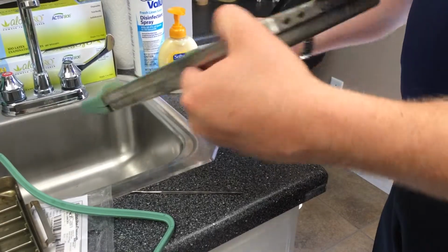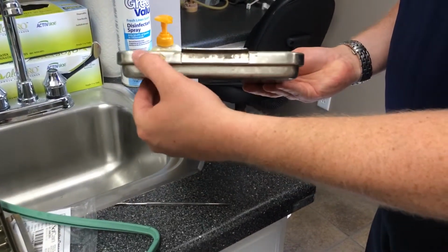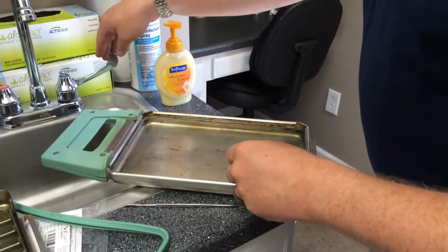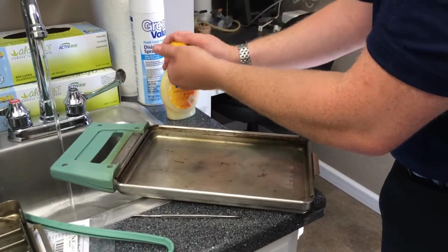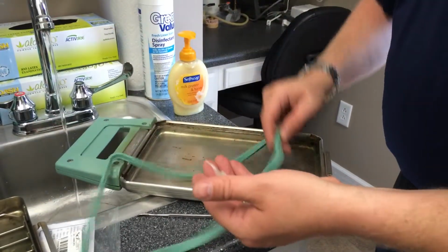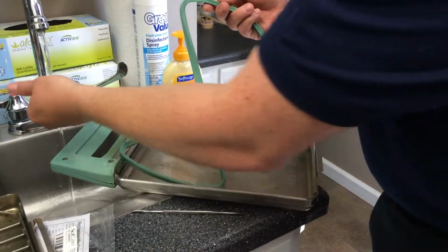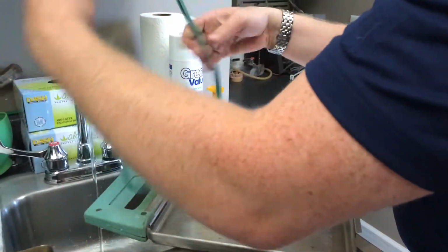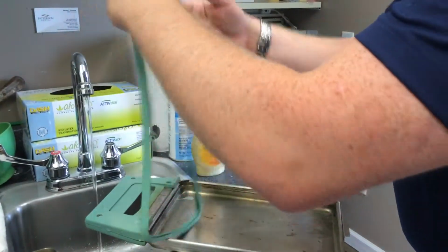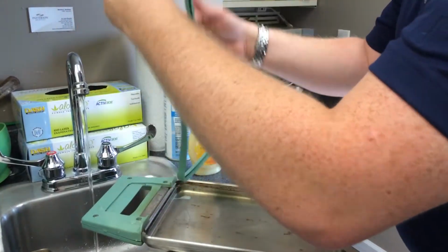So I'm going to start with the Statim tray facing me with these two holes to my left side. The trick is to have some thick, heavy-duty soap as a lubricant, to also have the holes ready to point towards me, and then get this just as slick as possible. You really can't use too much soap here. You want it to be very slimy.